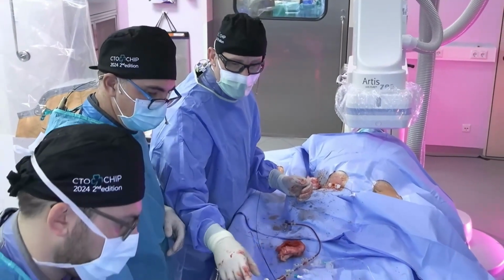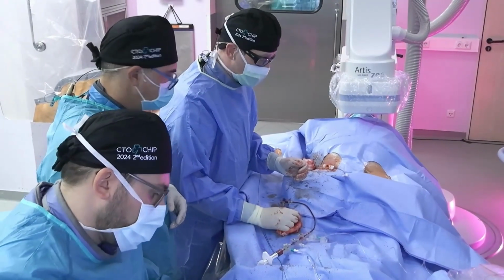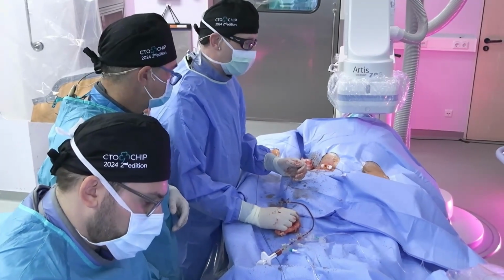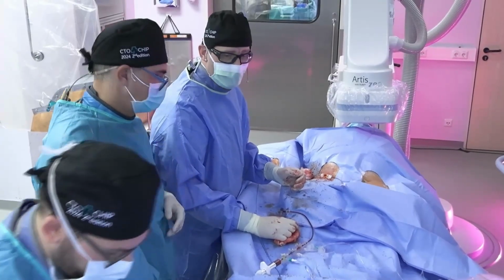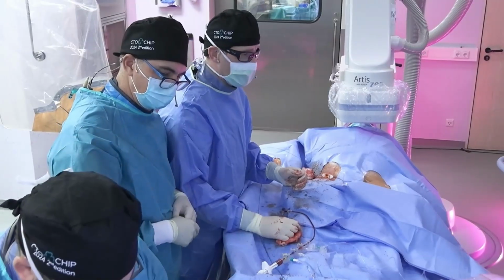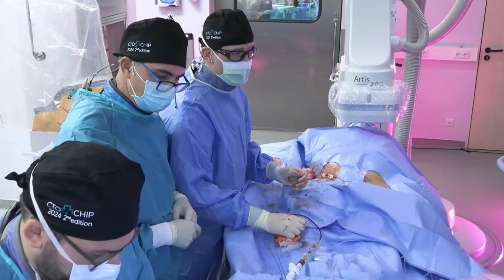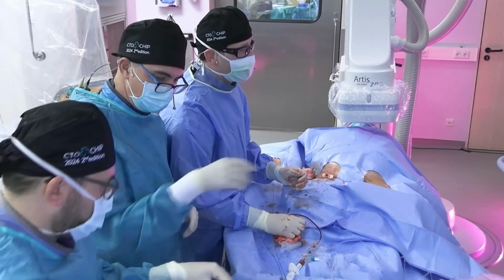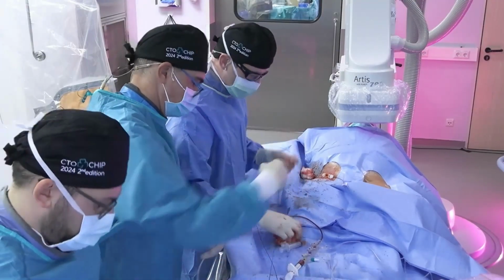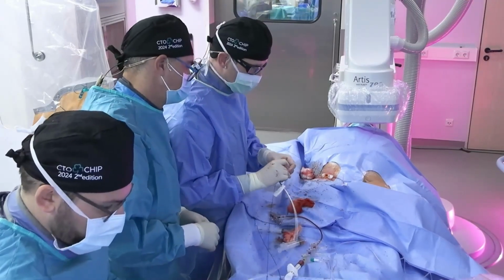So your main strategy would be retrograde first, right? I'm probably going to start antegrade, and if we are lucky, we just go wire to wire, basically in the middle of the stent, and then we are more or less done. But these in-stent CTOs might be challenging or surprising, so we may run into a longer procedure. If we decide we need support in between, it's most of the time not a good idea. So why not do it up front, and then if we have to go retrograde, we have support and we have time to go retrograde.